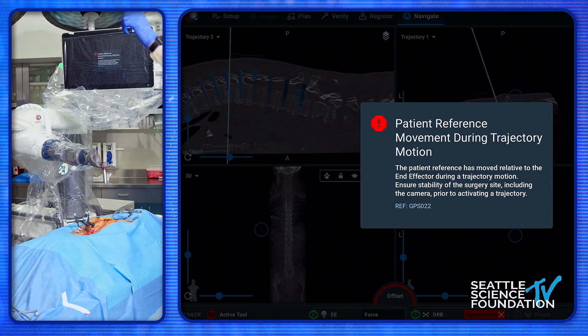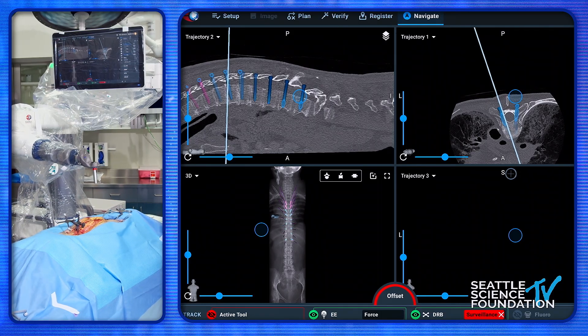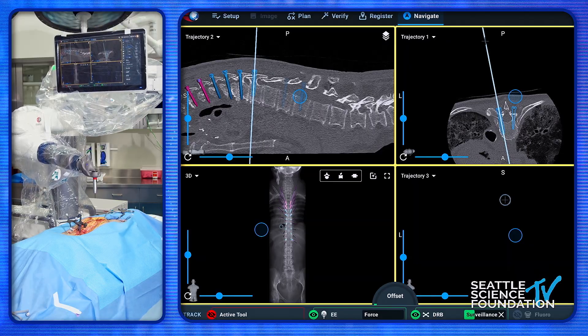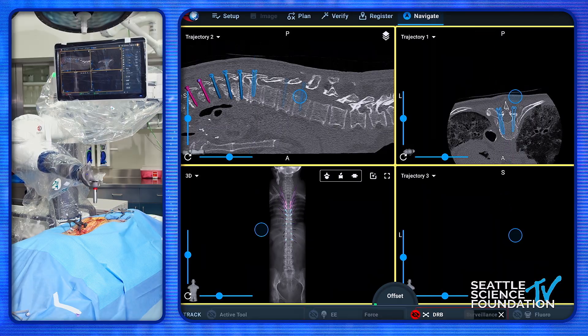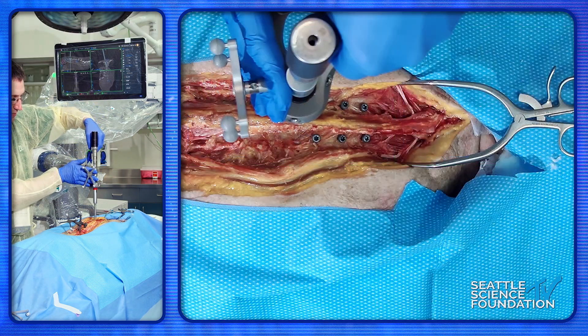This is a good workaround for when you're dealing with those high-grade cases. It's a little less convenient when you have the arm in your chest, but it is a way to get those screws you can't otherwise get — which has been a challenge for me, because I like to keep people on the Jackson table as much as possible so we're fusing them in an anatomic position.